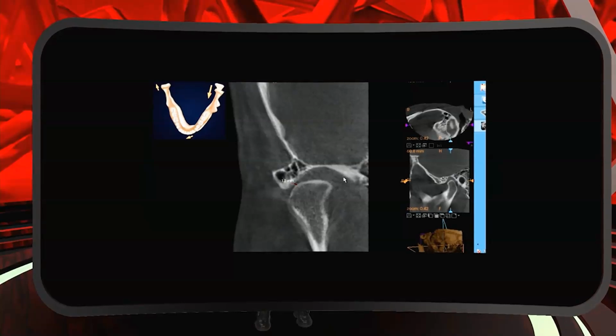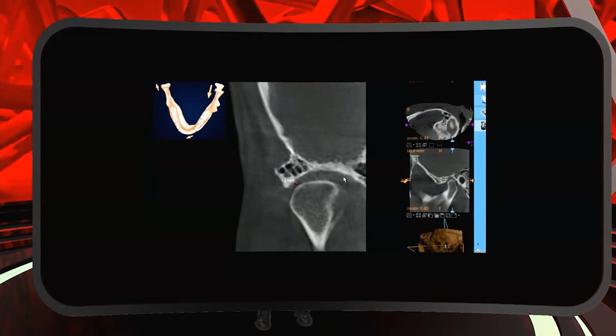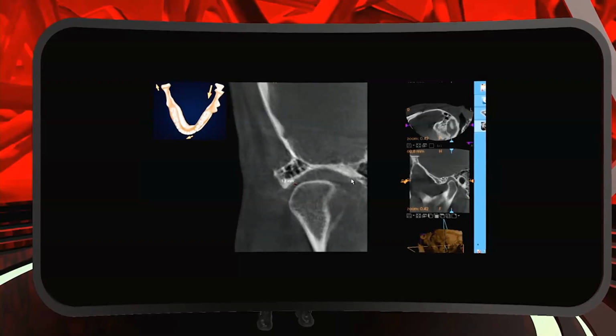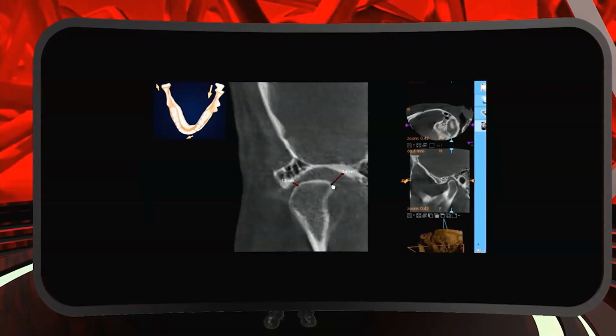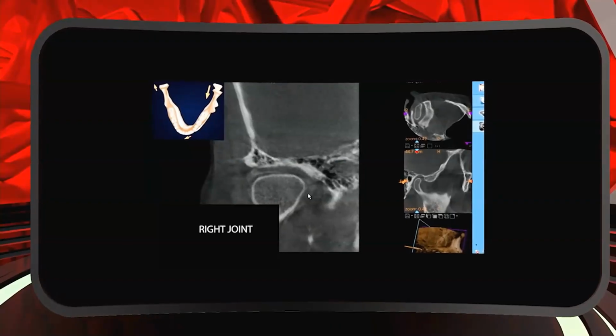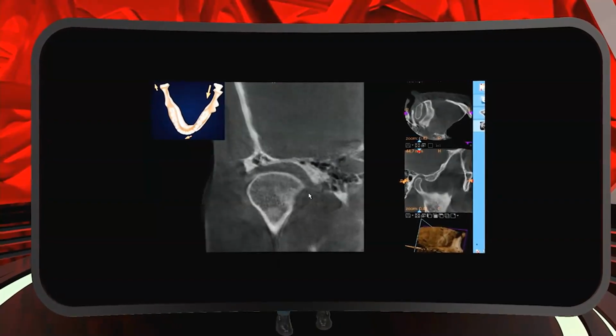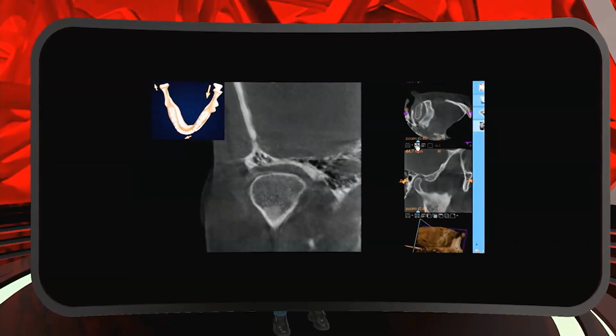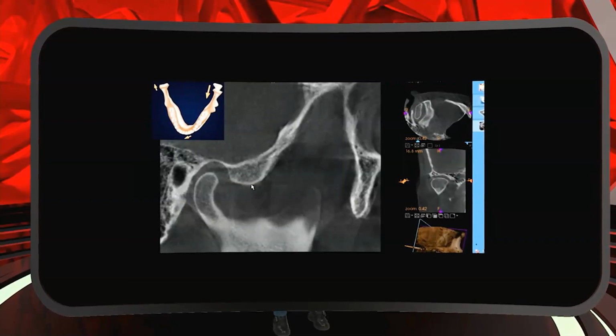The condyle is shifted laterally. Take a look at the medial distance. So when you know that the sagittal projection is pretty nice, but the coronal one looks, as you could see, then you think straight away about the rotation of the mandible.